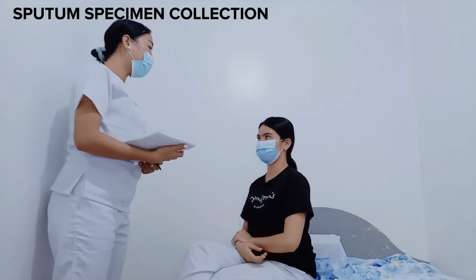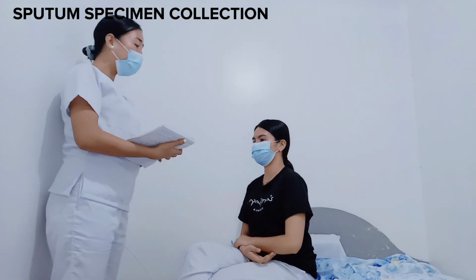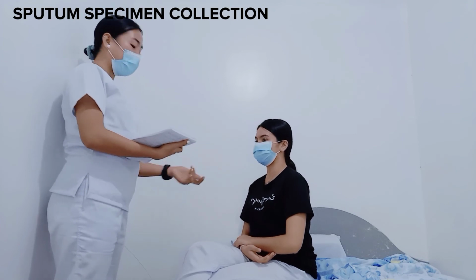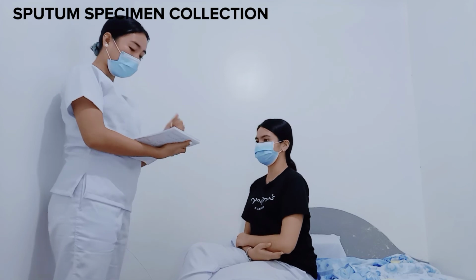Good day, ma'am. I am Camille Dungpa, your student nurse for today. Good day. Okay, today, ma'am, I will be conducting a sputum specimen collection. Is that okay with you, ma'am? Yes. Okay, so I have a few questions, ma'am. Is that okay with you?